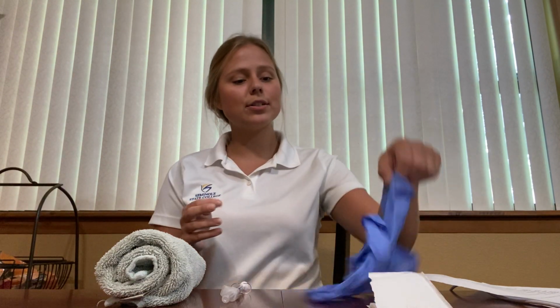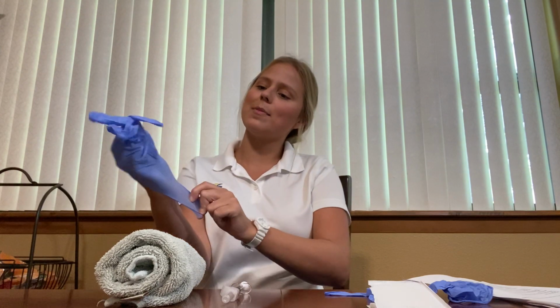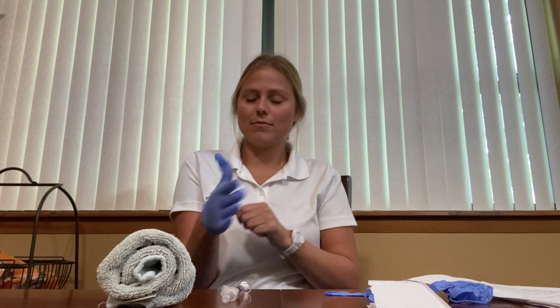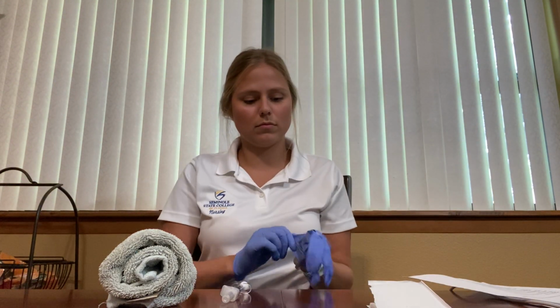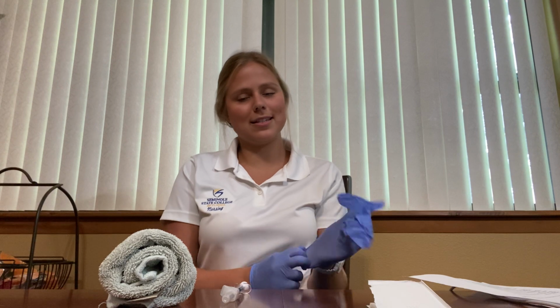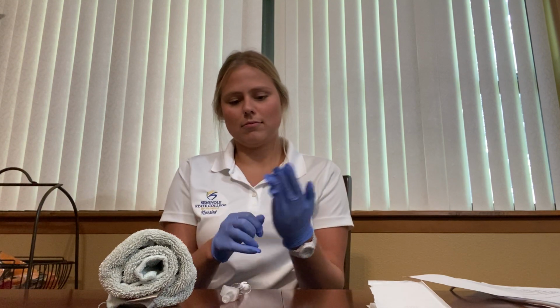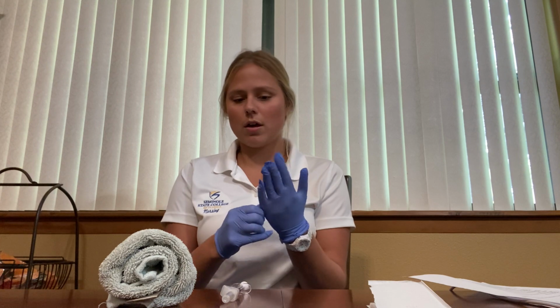Put on some hand sanitizer, don my gloves, and these gloves are a little small, so bear with me. So it might take me a second to put them on. Just making it work with what I have. Oops. Okay. I would definitely need to size up in the real setting. Okay. All right, there we go. Gloves on.